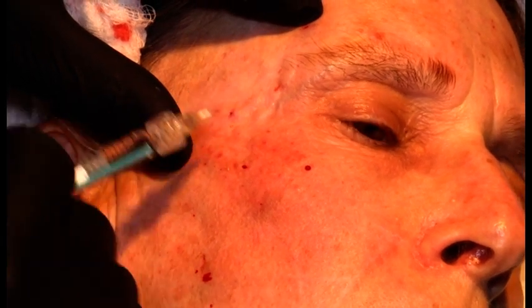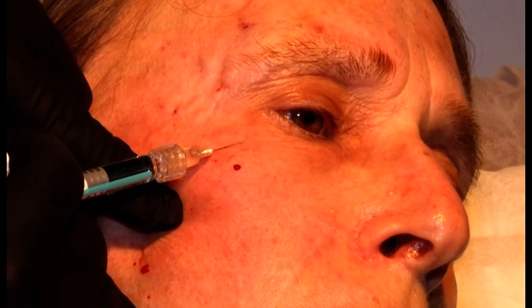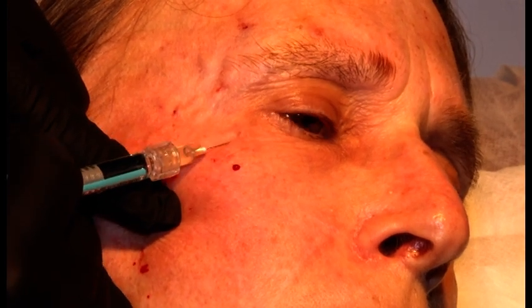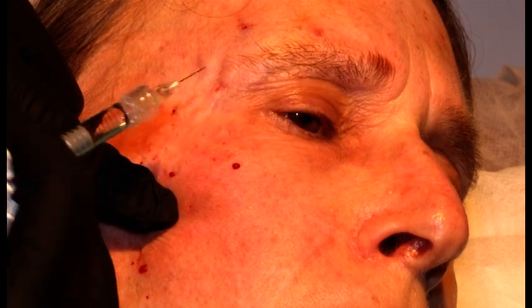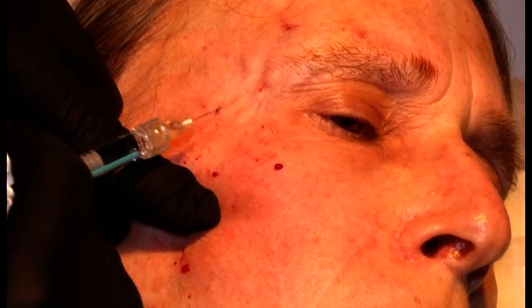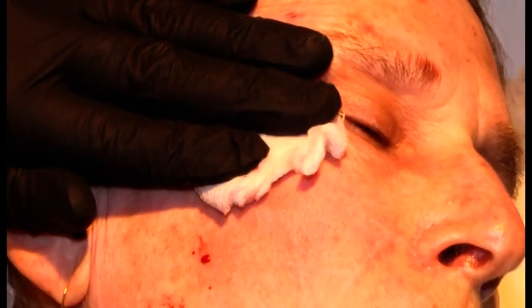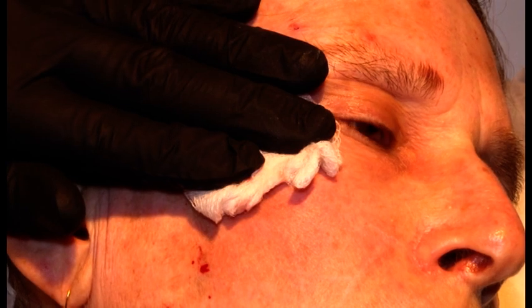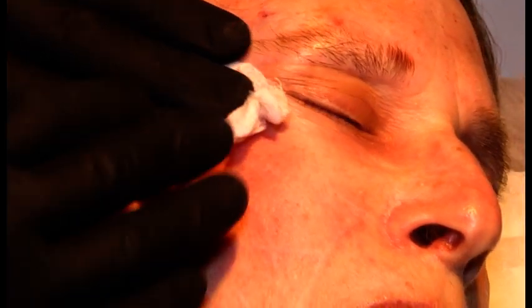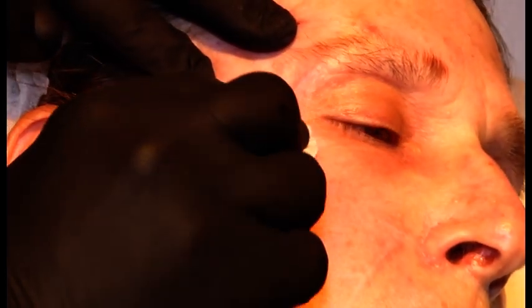And the nice thing about injecting it, especially in this area, is that you will have more of a refracted light reflection. Because of the tissue containing some water, it will play with light reflection, and it will give more of a glow to the skin because of the hyaluronic acid attracting some water.